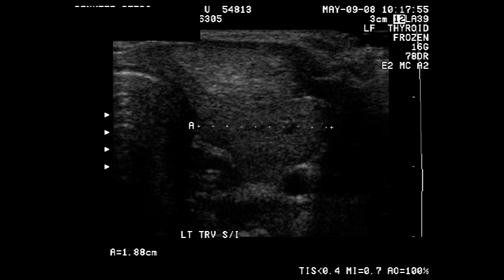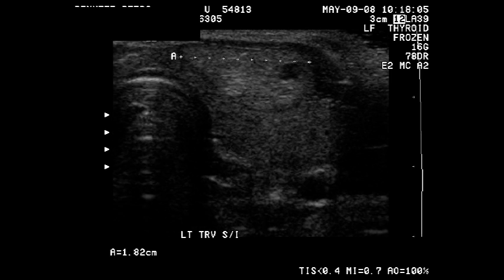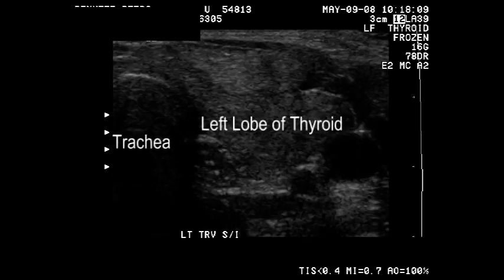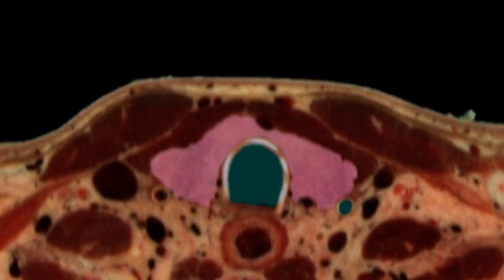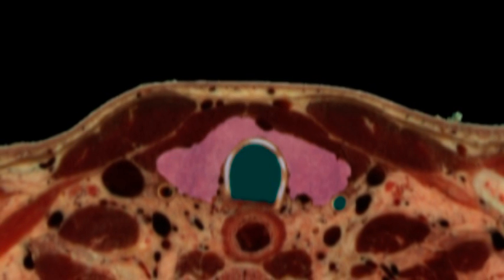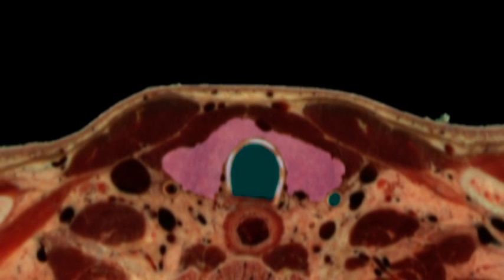Here we see another nodule, this one in the upper portion of the left thyroid gland. Notice here that the ultrasonographer has moved her probe now to the left lobe of the gland — we know because the trachea is medially.